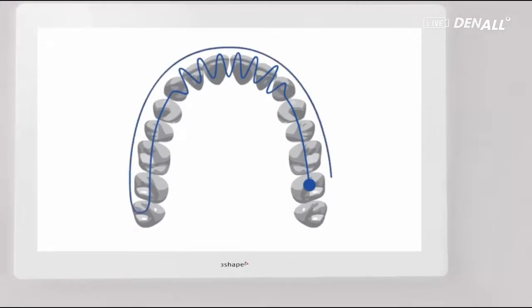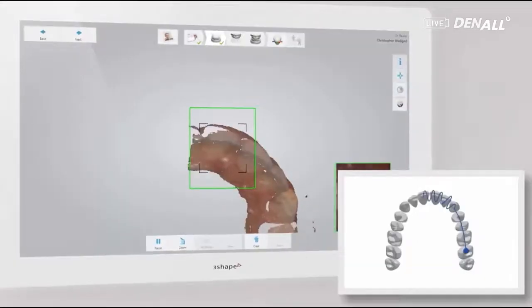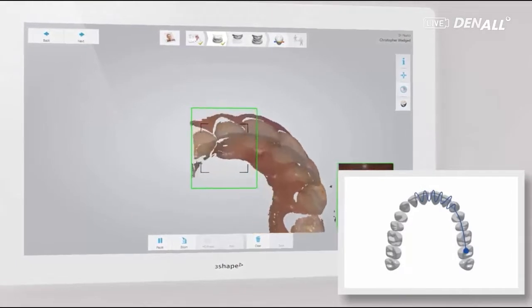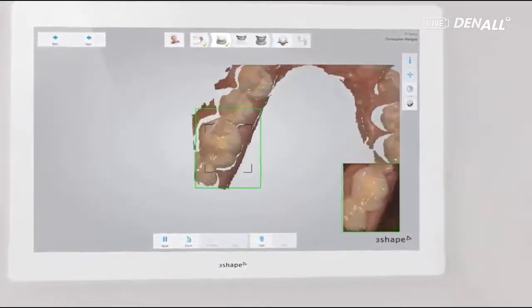Scan first the posterior occlusal surface, then from canine to canine attach pictures bit by bit, alternating between labial and palatal. The wide area is composed of many small images to get a lot of data. Unlike mandible, you need to attach palatal images as well.